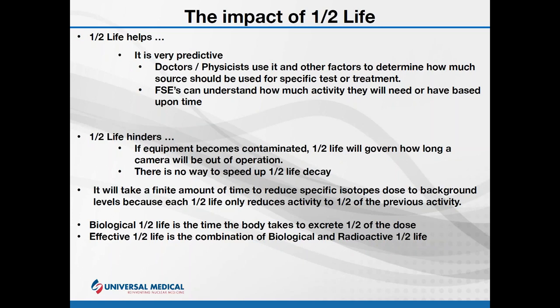If you have unwanted activity and it's elevated, it's going to inhibit you from doing service, from doing calibrations, and worse yet, you can actually stop the technologist from scanning patients. Nothing is worse than having a working camera. You need to do a PM, you come in, you accidentally contaminate the detector. This is not only going to stop your work, but it's going to prevent the site from doing scans until that unwanted activity has reached background levels. This can take days depending on the type of source. Technologists do not take kindly to you coming in with a working system and you leaving them with a broken one.